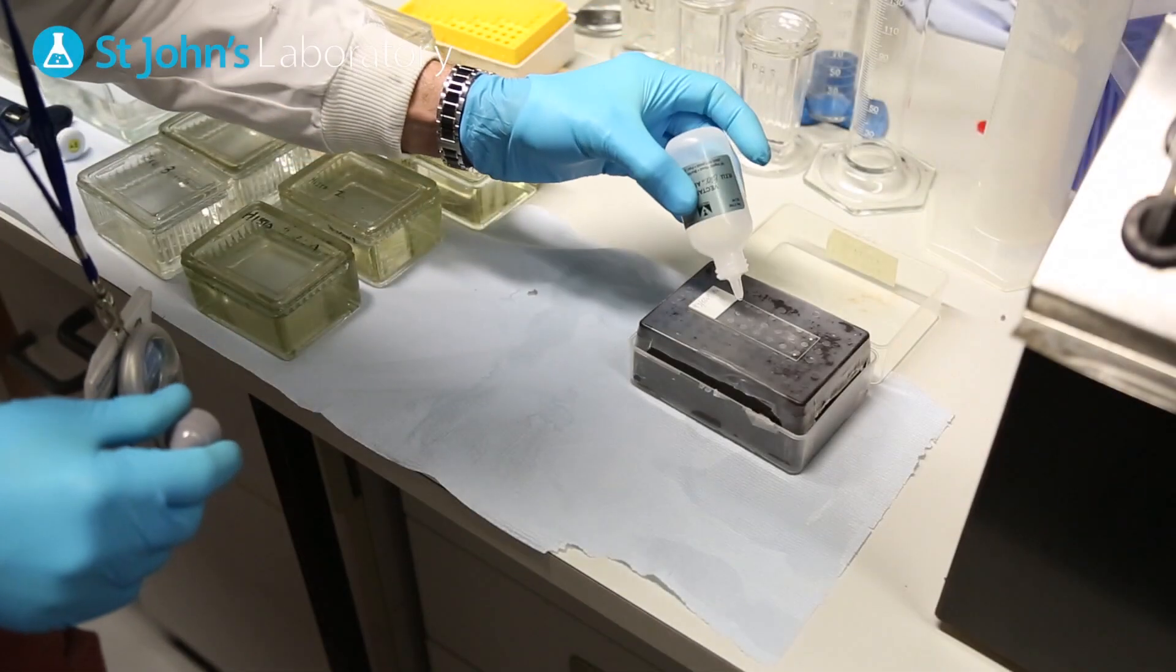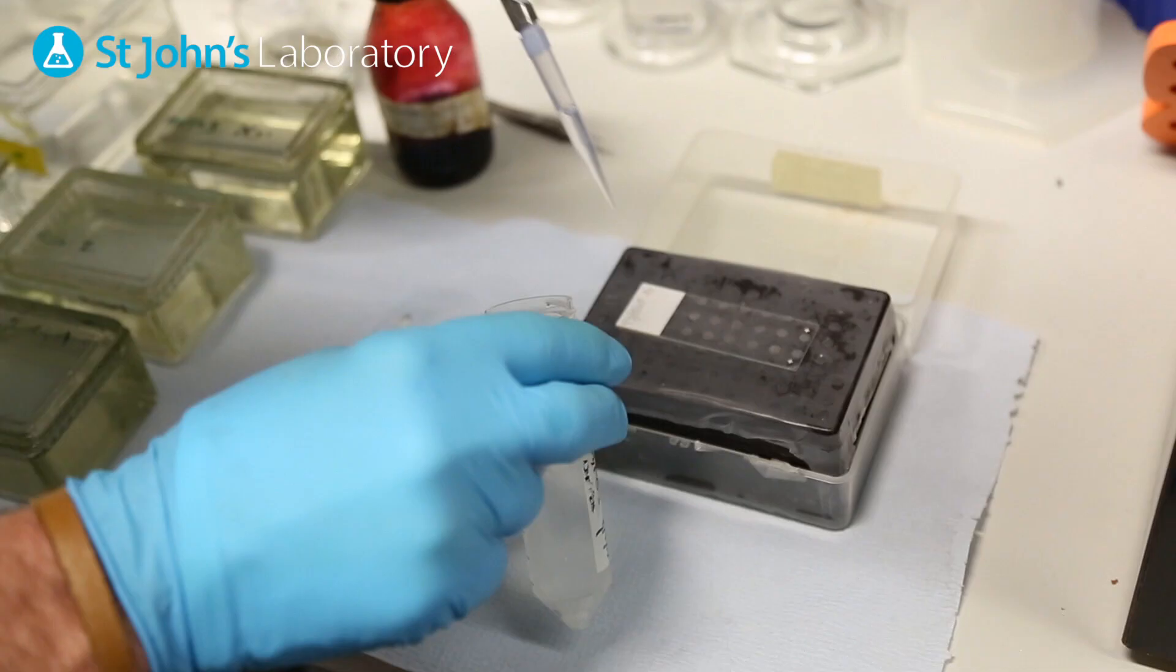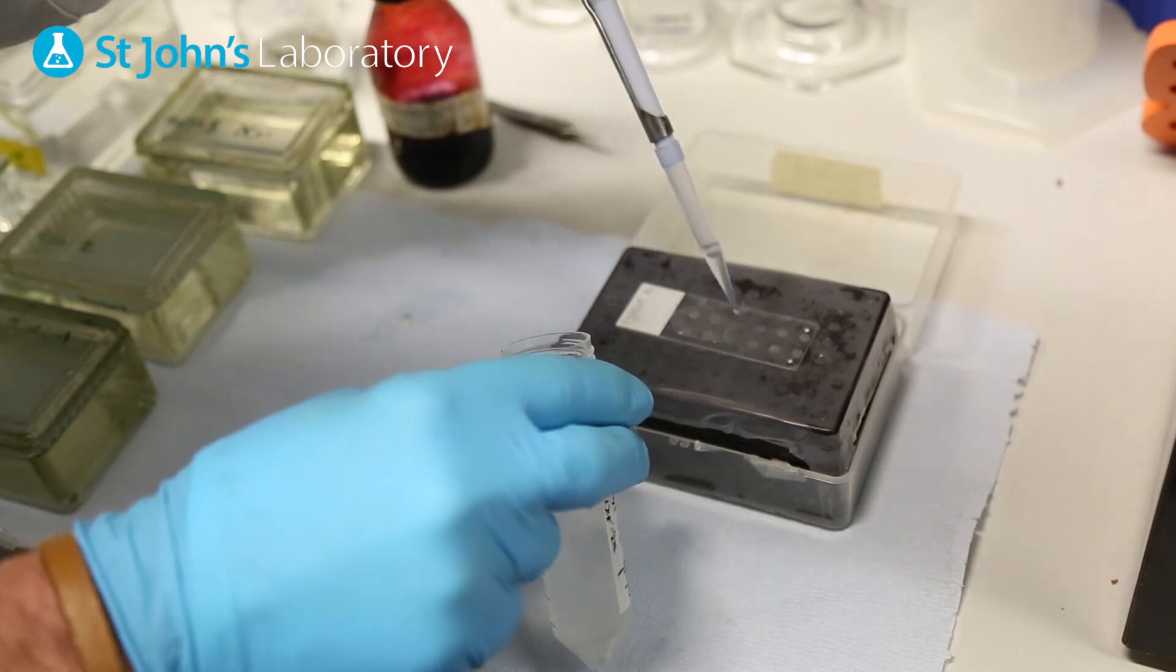The application of an ABC kit allows us to amplify the signal for individual binding sites. After this step, repeat the PBS wash process again.